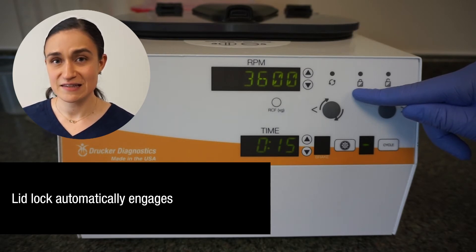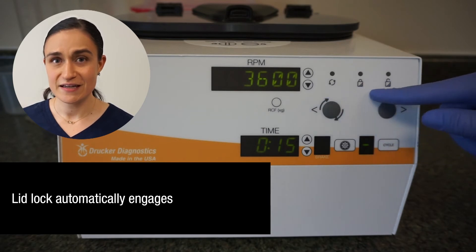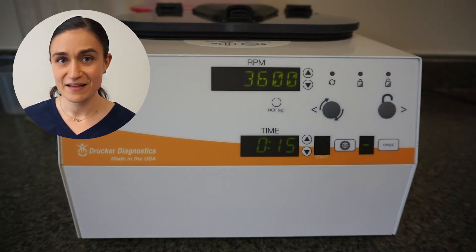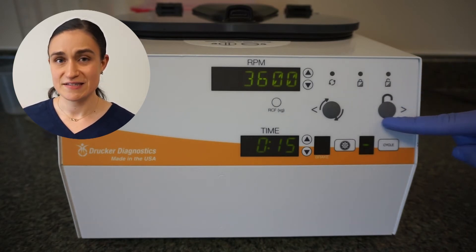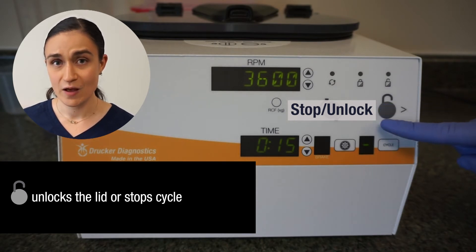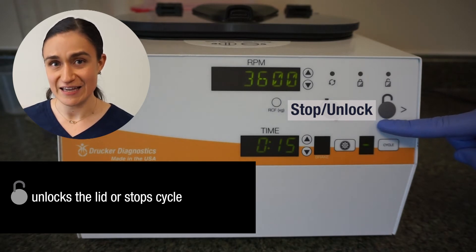If the lid is left open, the buttons will go dark, indicating that the centrifuge is ready for its next spin. Underneath those lights is the stop unlock button. This button can be used to either stop a current spin or to unlock the centrifuge if the lid lock engages and you need to access the samples.